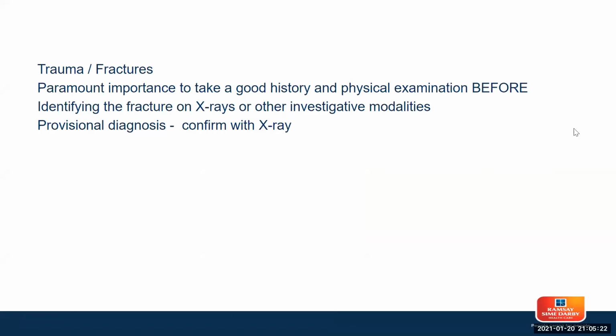Okay, so when it comes to identifying fractures, yes, it is also very, very important to actually take a good history and a physical examination before you go into looking at an X-ray. Always, don't make the mistake of trying to diagnose something straight off from an X-ray without examining the patient first.